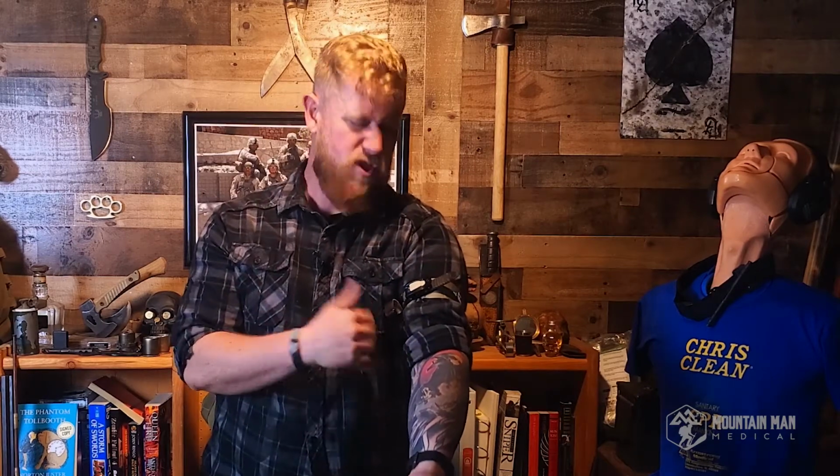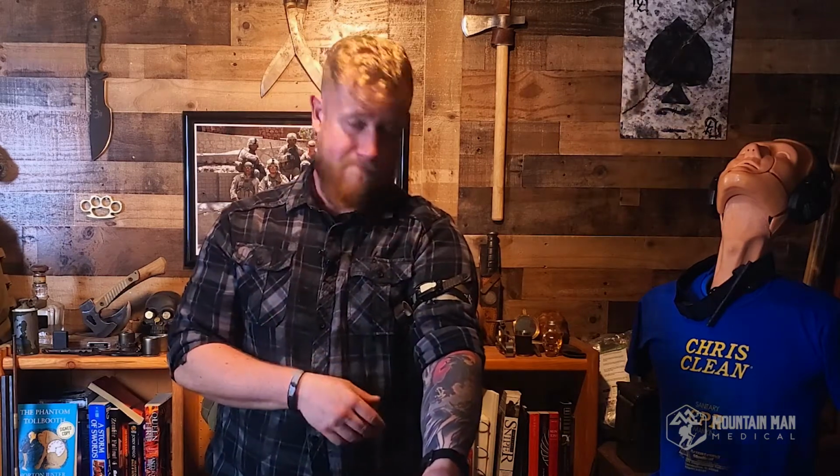And I can feel it. It feels pretty tight right now. And I have full occlusion of the artery. And I can guarantee you this feels more comfortable than the CAT or the SOF-T Wide. It's still not comfortable. It's uncomfortable for sure, but it's more comfortable. So there is an added benefit for that as well, especially if you care about your patients, which you should. That's it. That's how you apply it. That's an easy day.